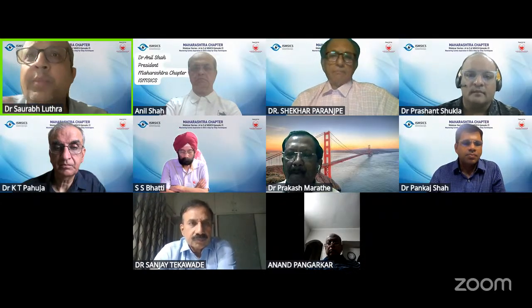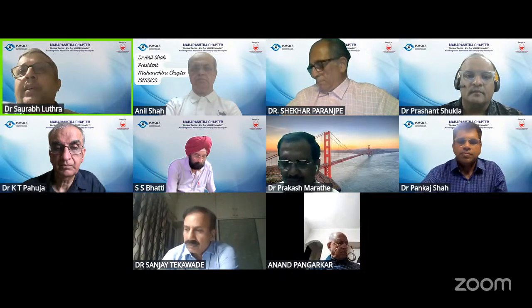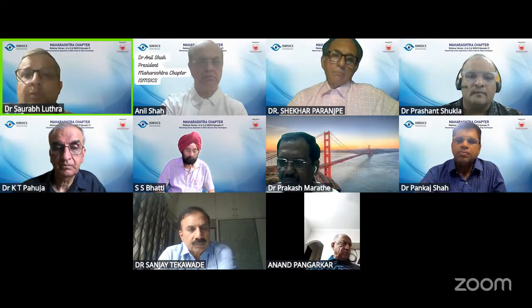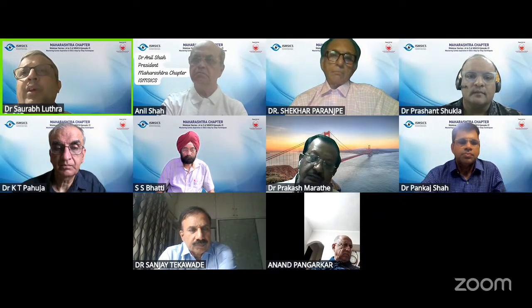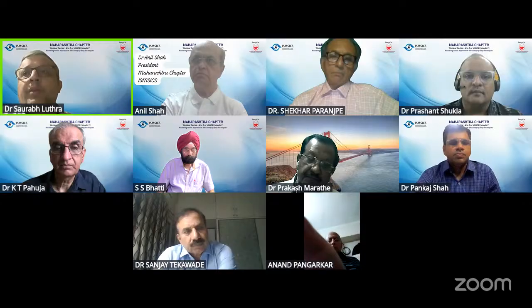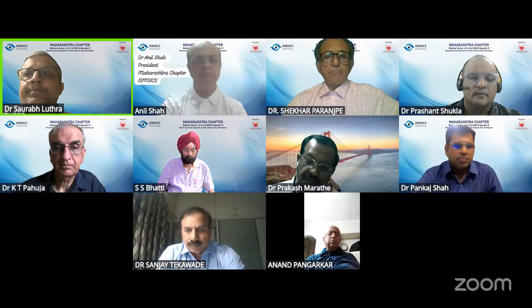I would say that, at least for the young surgeons who are probably getting into SICS. And of course, the AC cannula, as Dr. Bhatti also said, and Dr. Shekhar sir said, it is a boon to a lot of us. And with the advent of those cannulas, we have been able to do a lot of other maneuvers also. You start with the SICS and probably it somewhere helps you do a glued IOL later in the phase of your life. So these are my takeaway points.